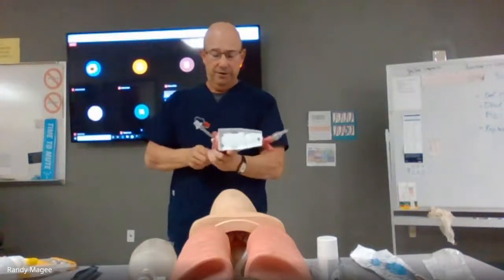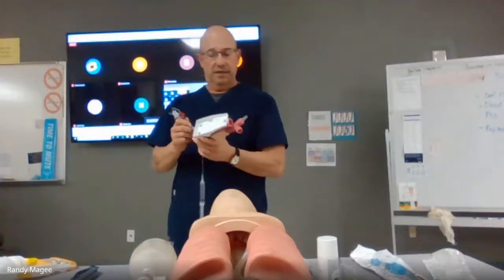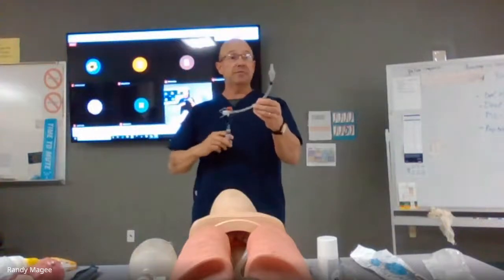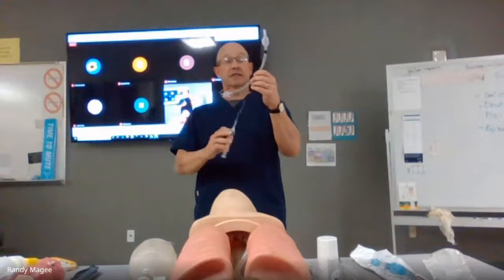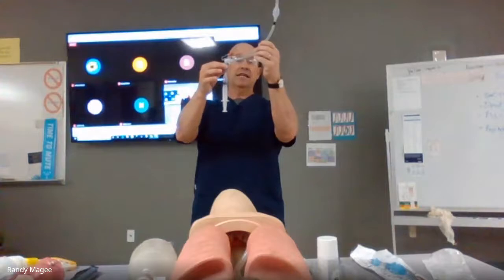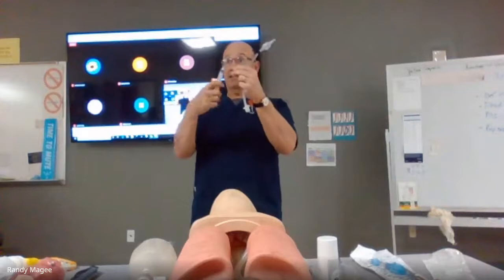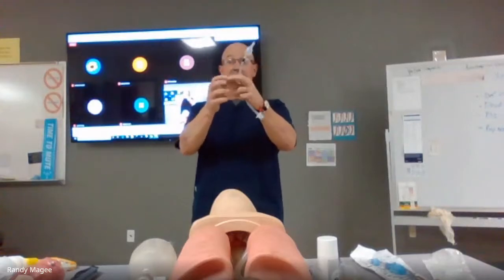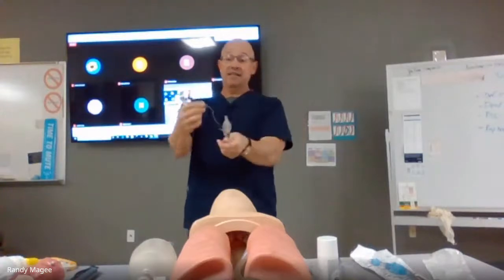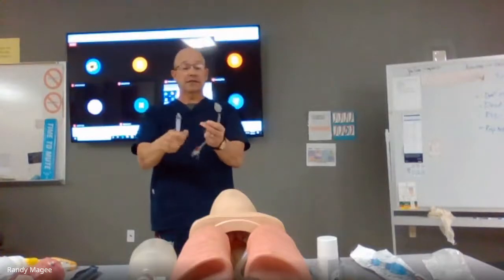All right. So when we get ready, one thing that I do is test the cuff while this is still in the package. I want to blow that up and make sure that cuff is inflated. Then this balloon out here on the outside, of course, I'm going to take the syringe off, because it'll just back-feed into the syringe because of the pressure differences. As long as this is inflated, the cuff is inflated. So this stays outside the patient, so I can continue to monitor it to make sure that the cuff's inflated.